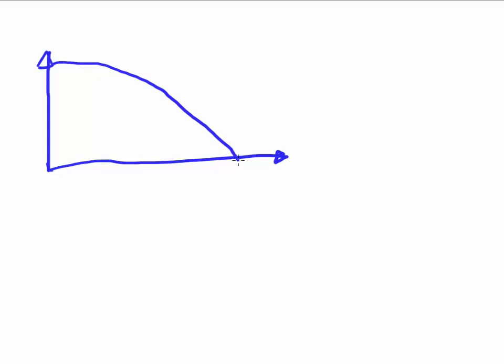So there is just a myriad of ways that can be utilized to determine differences between one tissue in your body and another. I'll just go over one here real quickly, and that is how long it takes different tissues to lose their signal. One may lose its signal rather slowly and one rather rapidly. And you can see by the time this one has lost all of its signal, this one still is quite bright. So we can see these differences on the images, and this is what the radiologist sees. So that's just one of very many ways.